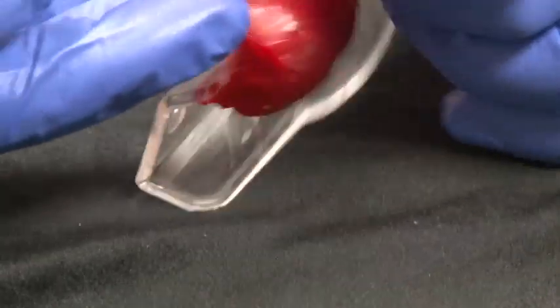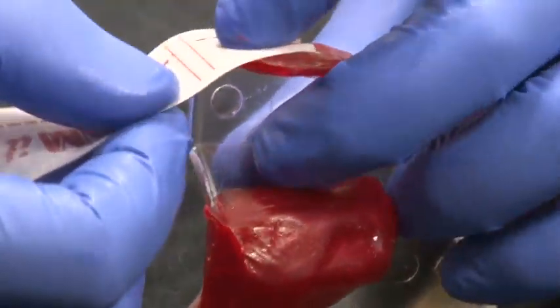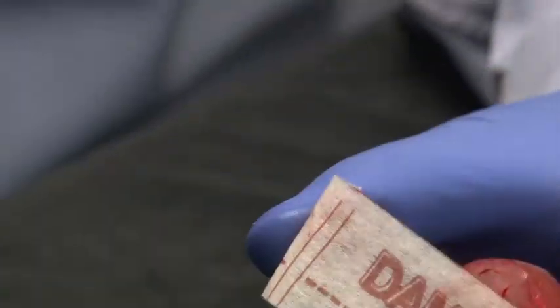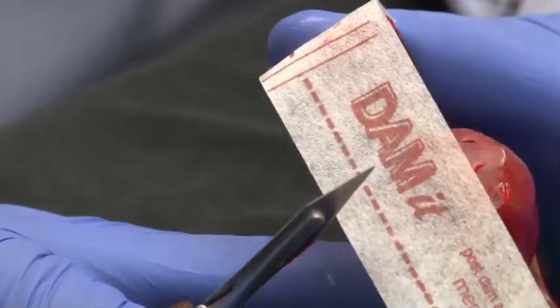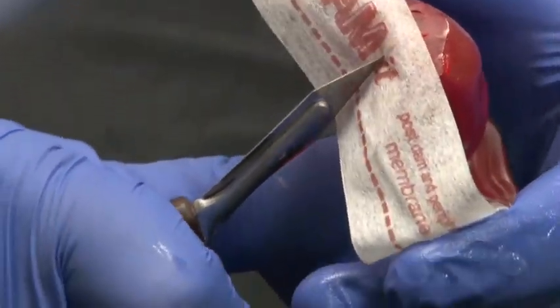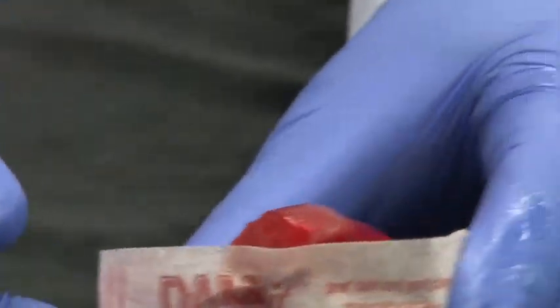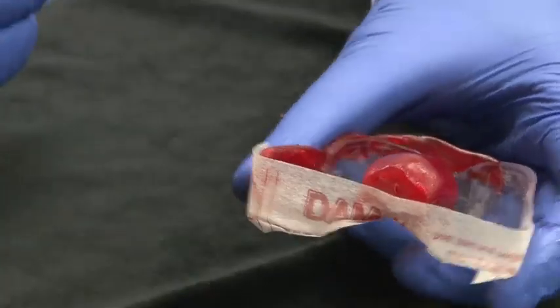And we place it across the back of the tray from one end to the other. Make a little notch with our knife in the middle of the pallet and fold it up. Very quick and easy.